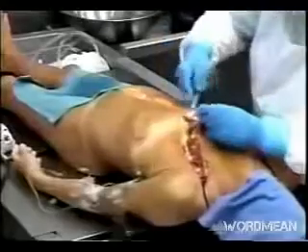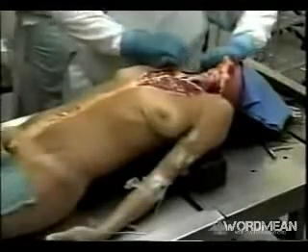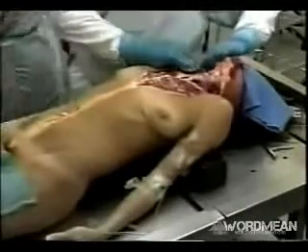What he's cutting through is subcutaneous fat and muscle. The first flap that he's reflecting is being done so that you can expose the neck organs, which also will be dissected out and examined as part of the autopsy.